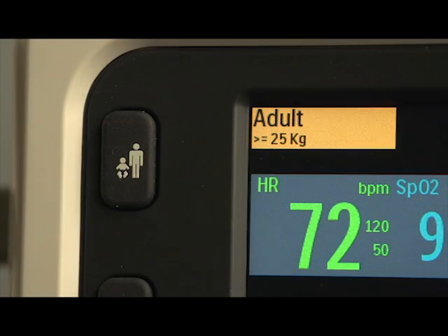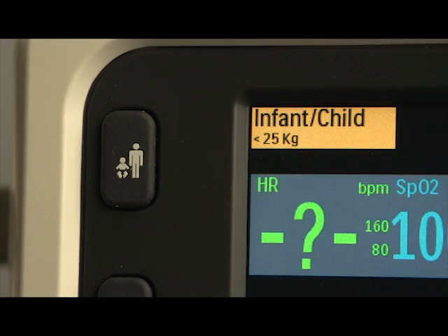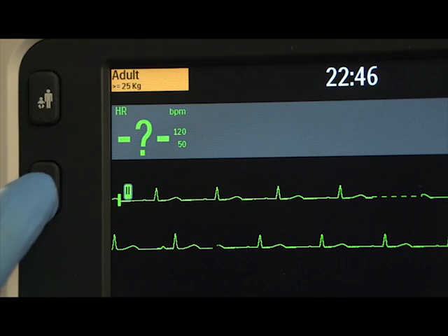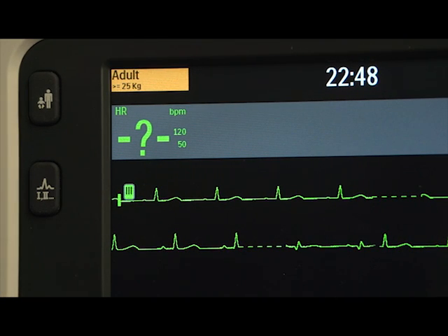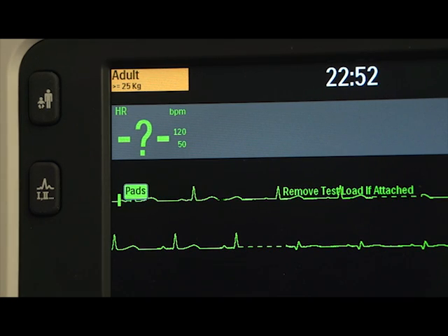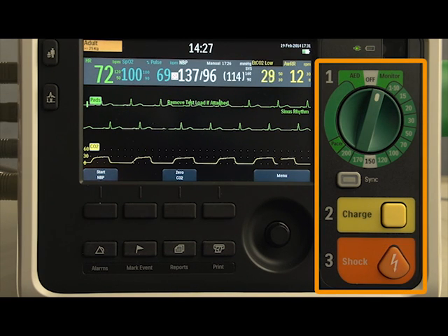This button switches between patient categories and changes alarm limits to the new patient category. The Lead Select button changes the ECG lead in Wave Sector 1, cycling through the available ECG waves and changing the displayed wave and its label. These controls are used for automated or manual defibrillation and synchronized cardioversion.